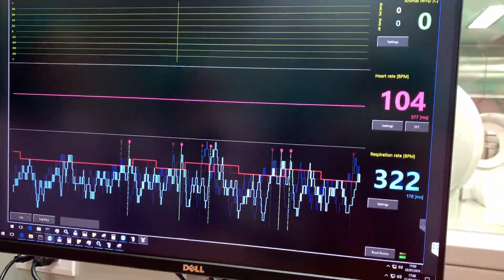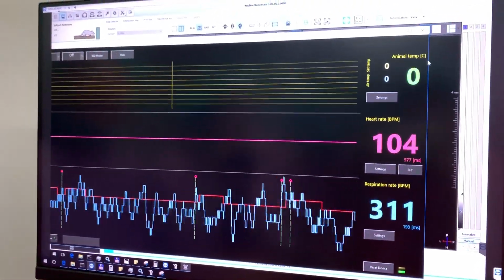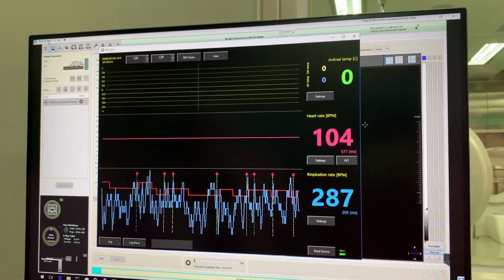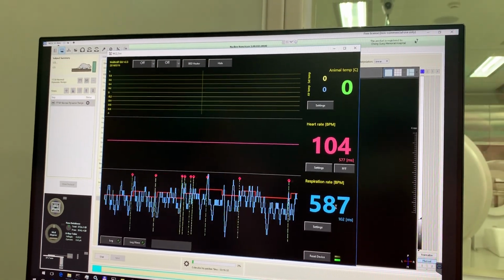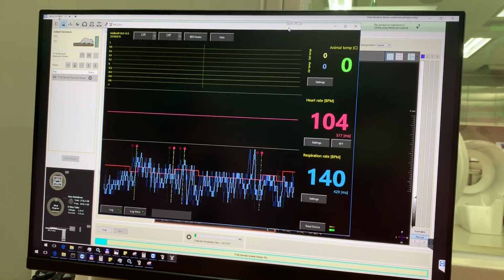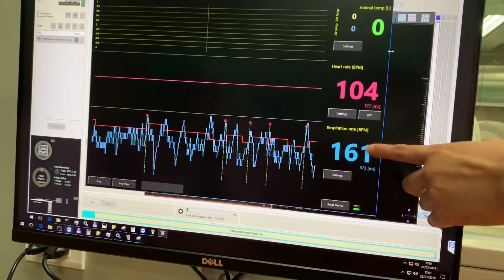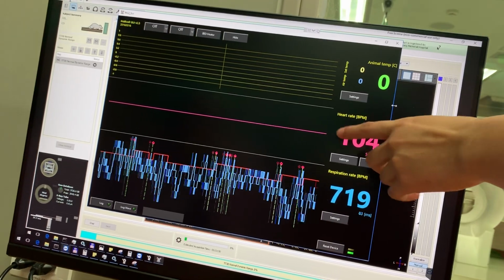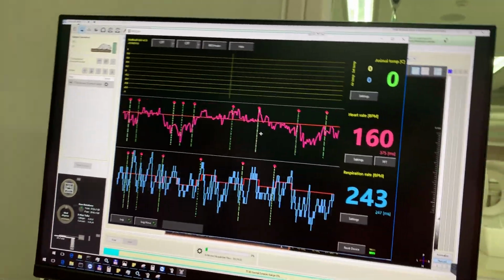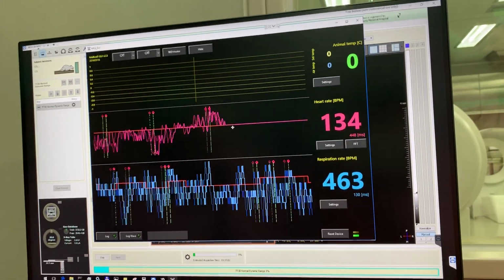This is for gating. The respiration signal keeps jumping. Yeah, this is the noise we also saw on the display on the side of the docking unit, if you remember. Which one is this, the white one? It's the blue one. This one is the respiration pad. The ECG is the one below, and this is the respiration pad. The white one is the rectal probe. Is it necessary to use the rectal temperature probe?